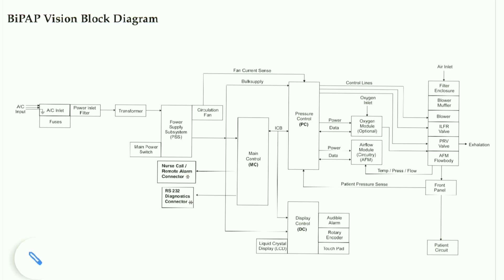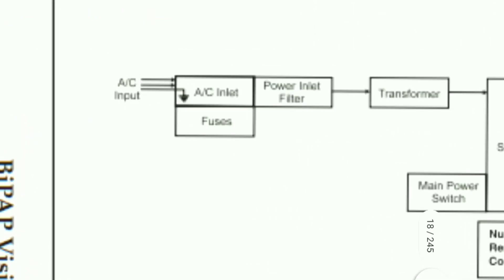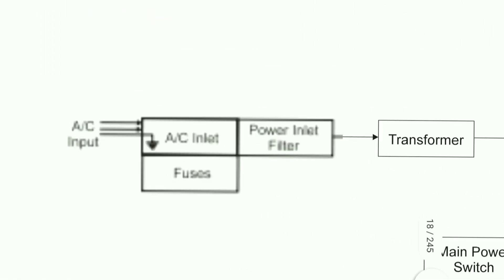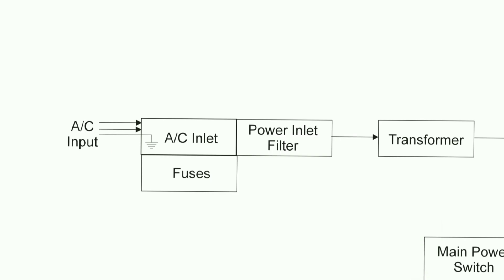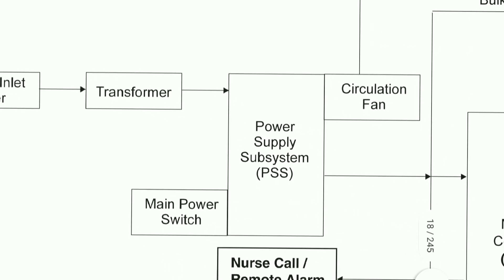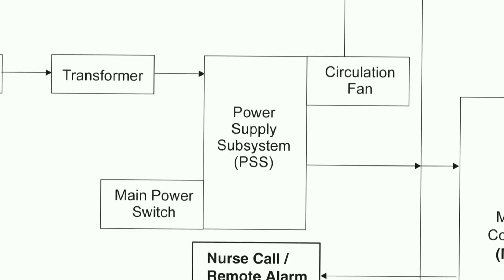From the AC power, the AC input goes to the AC inlet, then there are fuses, then the power inlet, and it goes to the transformer. From there it goes to the power supply system — the PSS — and then there is the main power switch and circulation fan.